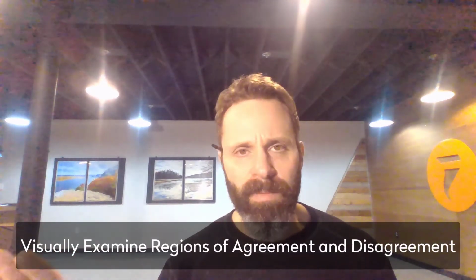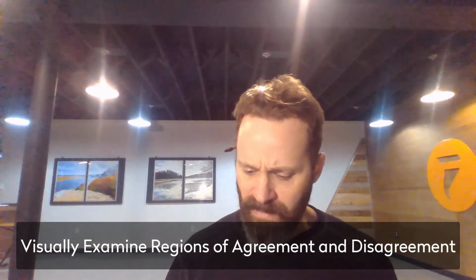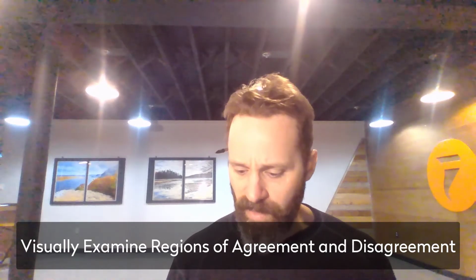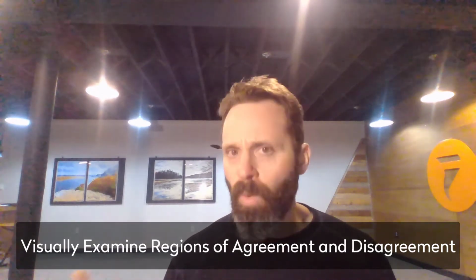Then while we're looking at those pictures, we're going to move around through 3 dimensions in the image set, and we're going to comment on where there are regions of agreement and where there are regions of disagreement, just qualitatively. By the way, all the data I'll be showing today, any of you who are C3RO participants can log in and actually interactively go through the results yourself, because we've posted the consensus grids online in the read-only results workspace. So if you're a Prono user, you know what I'm talking about.